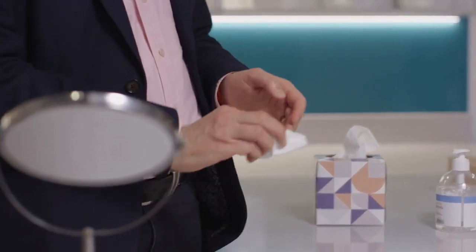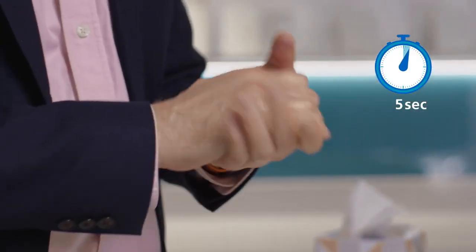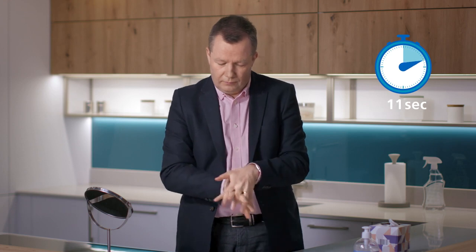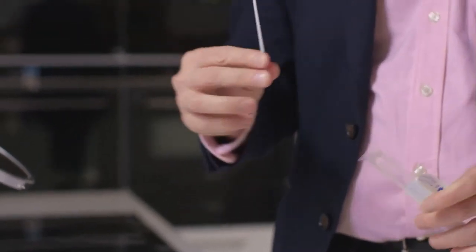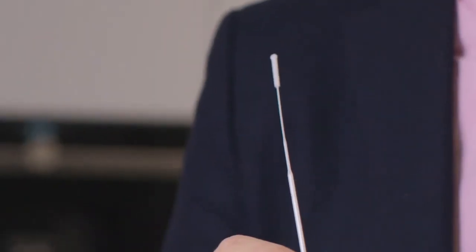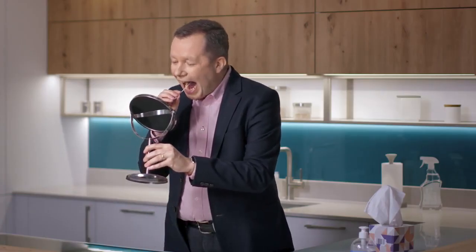Blow your nose and wash or sanitise your hands again. Remove the swab from the packet — do not touch the soft part of the swab. Open your mouth wide and rub the fabric tip over both tonsils, or where they would have been if you'd had them removed. Do this four times on each side.